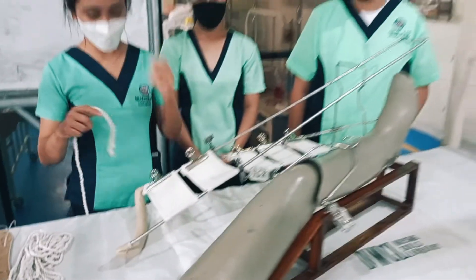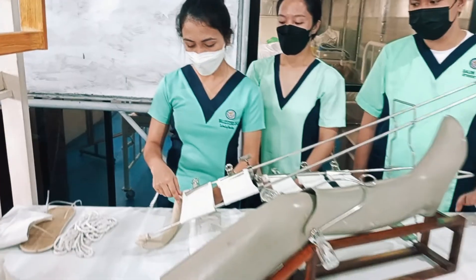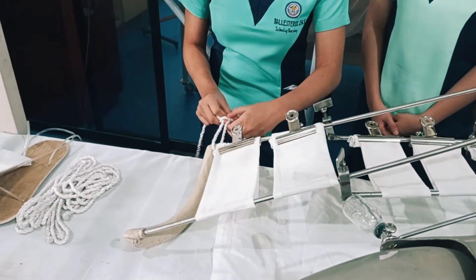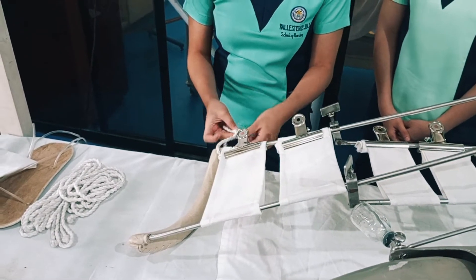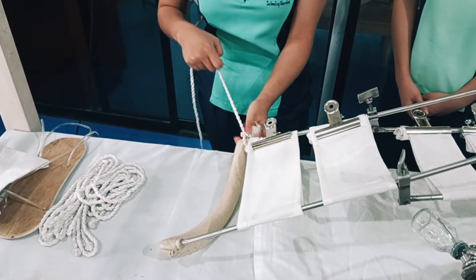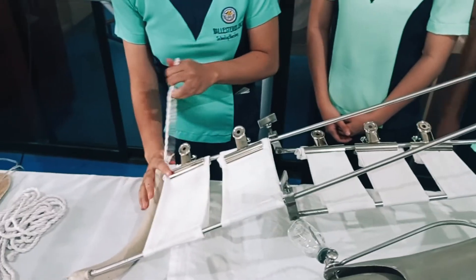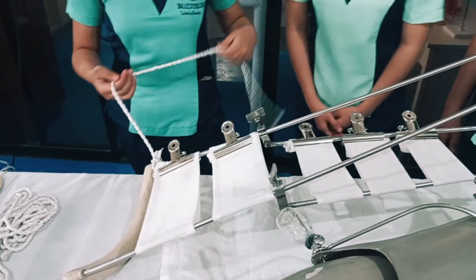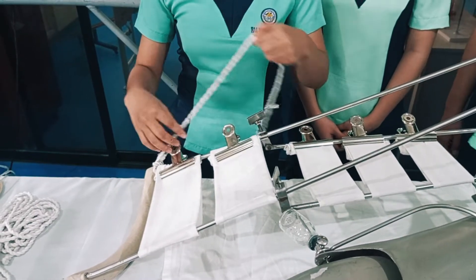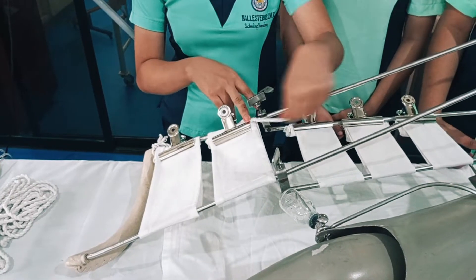Tie the short rope to the medial junction of the Thomas splint using a cleat knot. Then tie the other end of the short rope to the medial bolt of the Pearson attachment, temporarily.